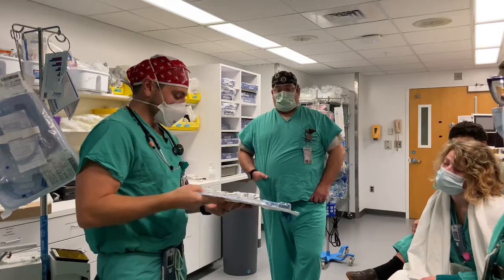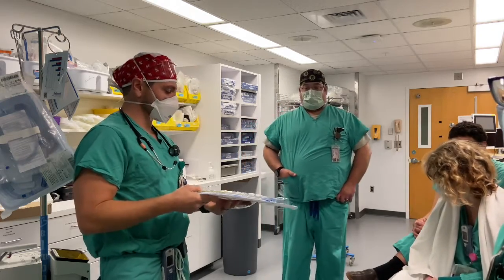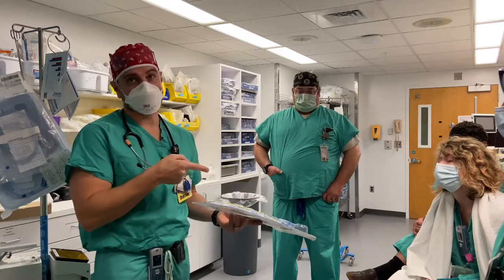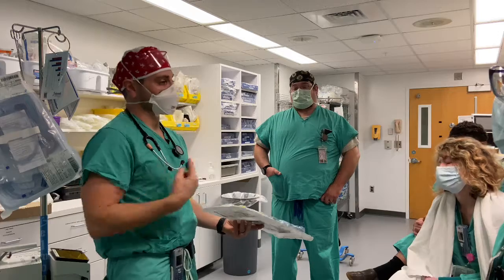Okay. So why do we use these? Well, most of the time, it's because we're concerned about being able to intubate somebody, so difficult intubation. Oftentimes it's easier to put a single lumen tube in than a double lumen tube. Or we're nervous that if we extubate, we won't be able to re-intubate.